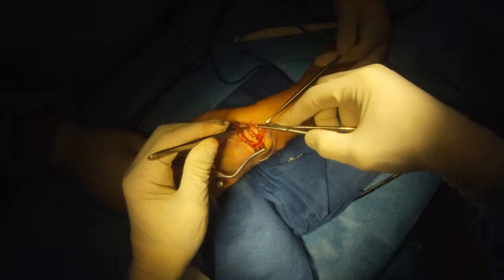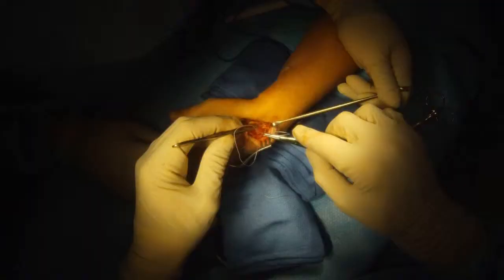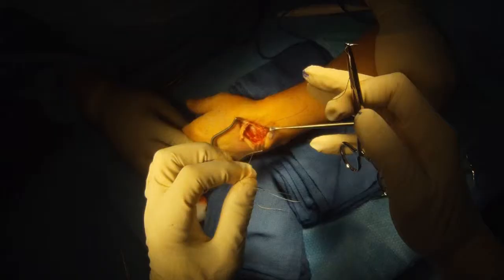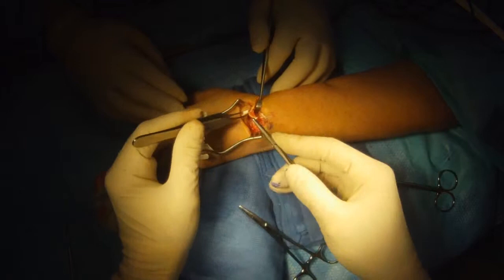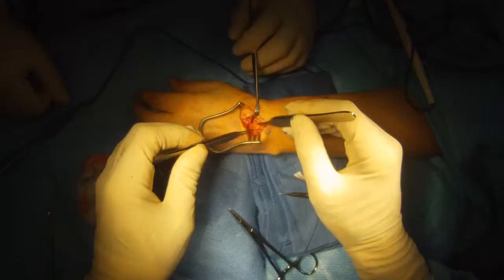I'm going to remove the temporary K-wire so there are no wires left in the wrist. We'll continue to tension and tighten the scapholunate reconstruction so it's nice and firm. Then we'll remove the remaining excess graft.